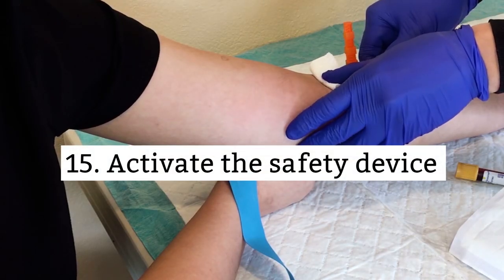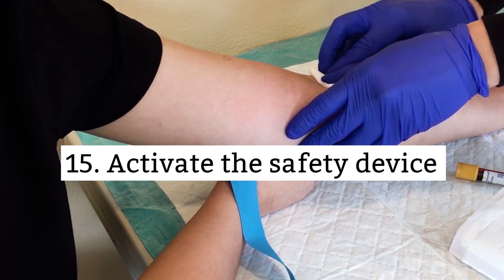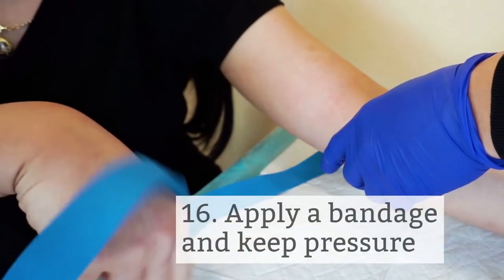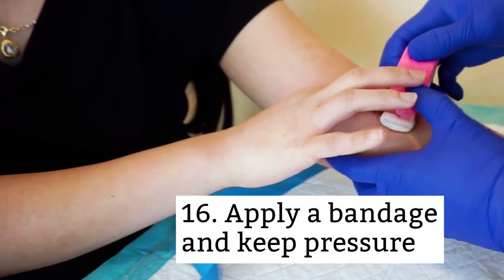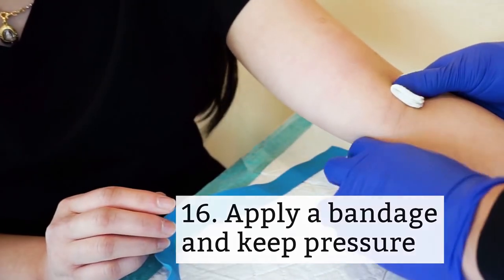Fifteenth, once the needle is out of the patient's arm, activate the safety device immediately and throw the needle away in the sharps container. Sixteenth, put a bandage on the patient, then ask the patient to keep pressure on the site for about 10 minutes.